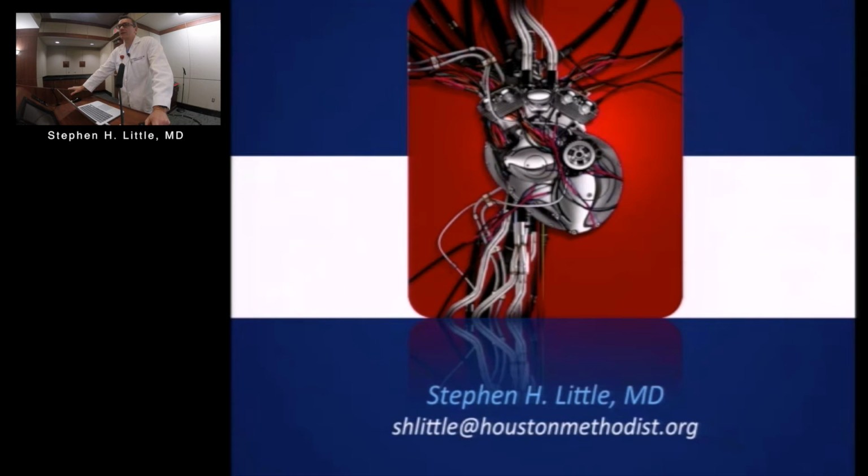And then the other wild card there is how many devices you're going to put in. And functional is tougher because the whack-a-mole concept is more evident if you've got big billowy leaflets and more of them, whether that's a Barlow's. I think now we've probably done 45 MitraClip patients, and we've seen almost every representation of the mitral spectrum, from Barlow's to P3 to P1 to functionals to post-ring.